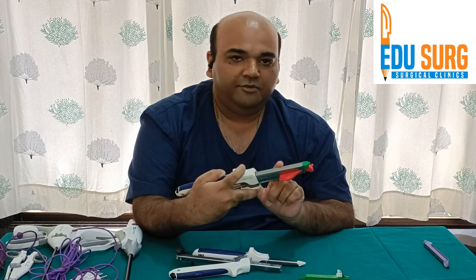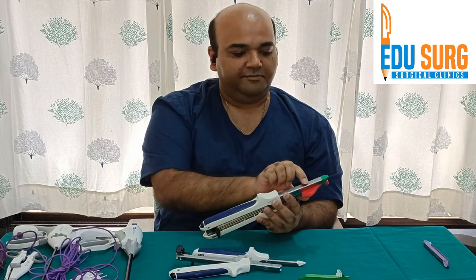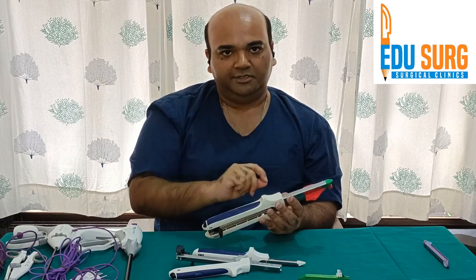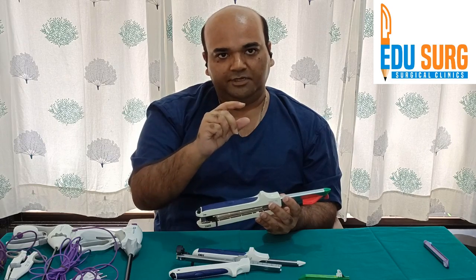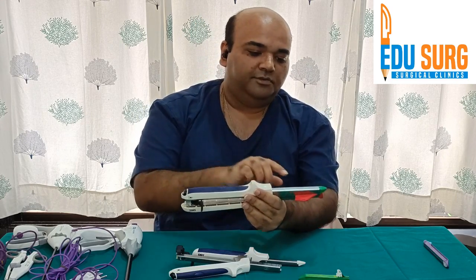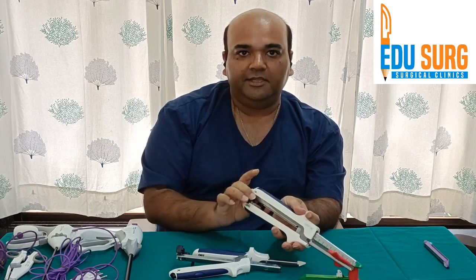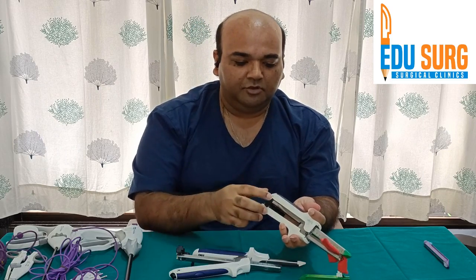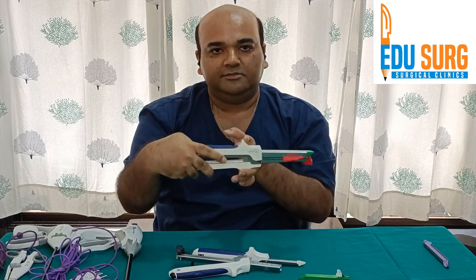Once you have locked the stapler you wait for around 20 to 30 seconds. We wait because the stapler causes compression of the tissue and the staple height is decided as per the compressed tissue. If you don't wait, there is a high chance the tissue thickness may not be properly traversed by the stapler. So always wait 20 to 30 seconds after applying pressure. This is the firing knob — you can use it with the right as well as the left hand. Two fingers are used to hold the stapler so that it does not move during firing.